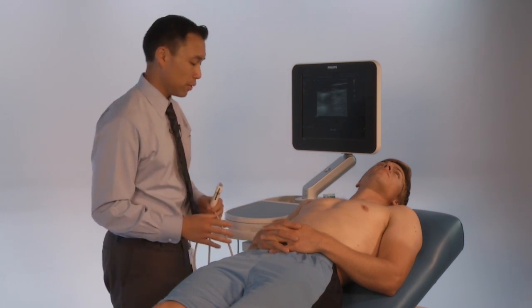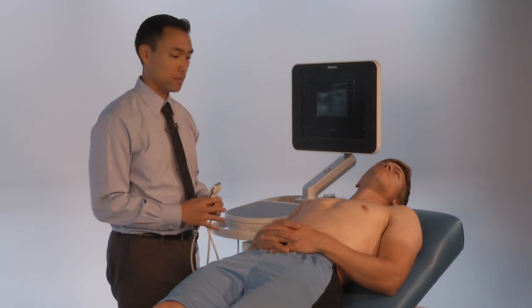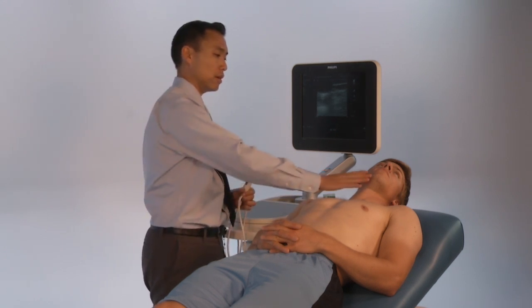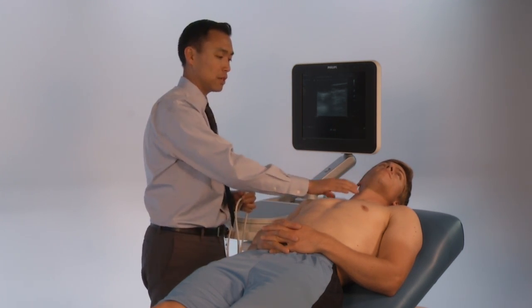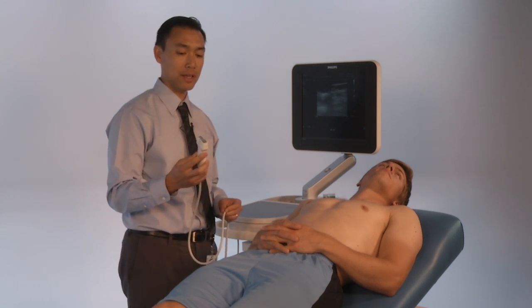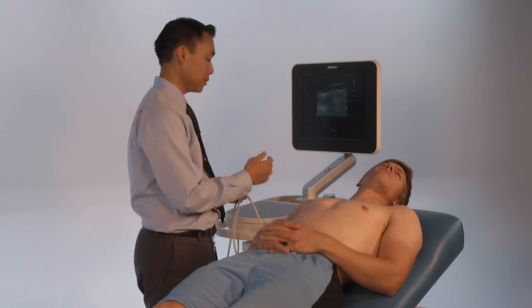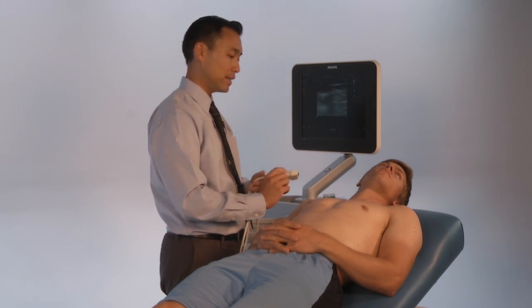We have the patient at about 30 degrees elevation with the neck rotated to the left, exposing the right neck. We're going to use a linear probe on a vascular setting, with the indicator towards the patient's right.